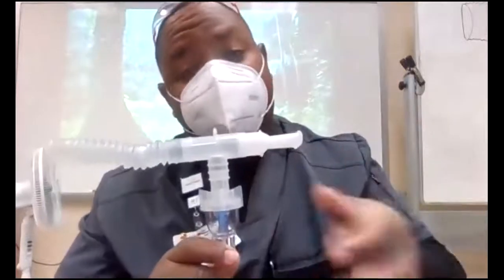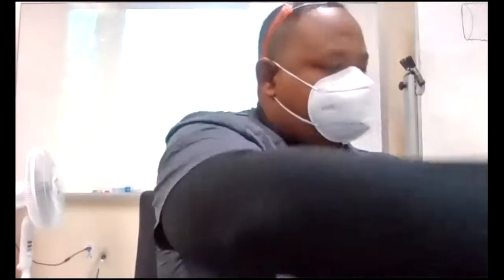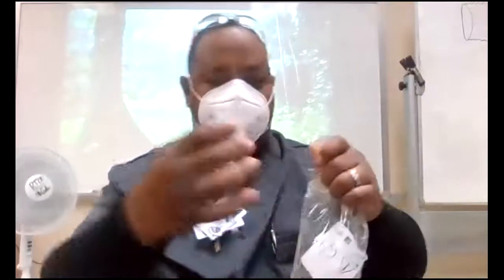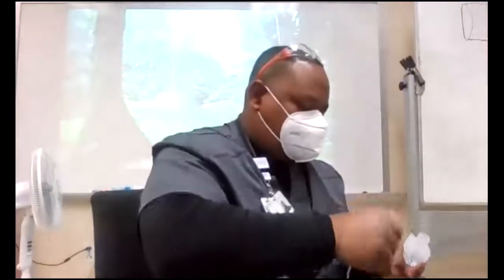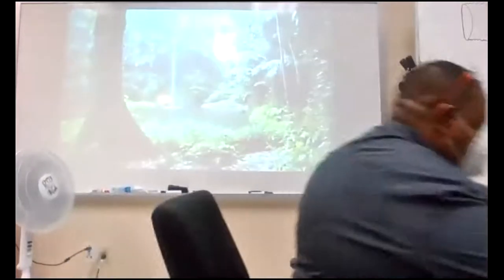Now I'm going to show you how it nebulizes with the baffle. All right, so I'm going to take it back apart, put it down, and put my medicine in. We're going to pretend that the saline I'm about to put in there is actually medicine. So I'm going to take this apparatus that I was using earlier and pour a little bit down in here. Now, you wouldn't have this much medicine. It came out kind of fast, but that's all right. I'm going to put this on my E-cylinder so you can see how it works.